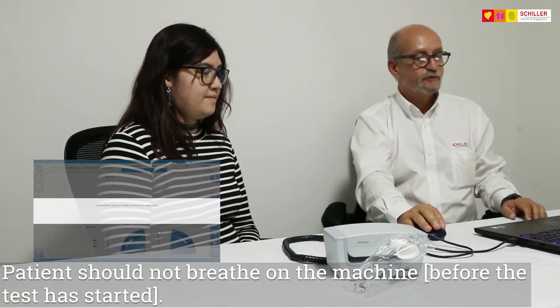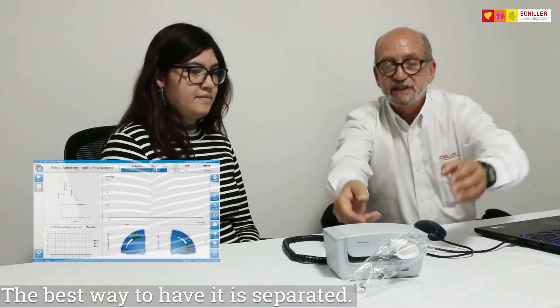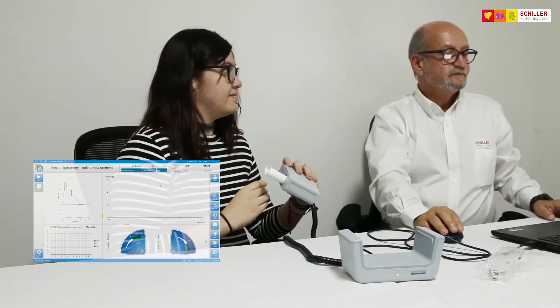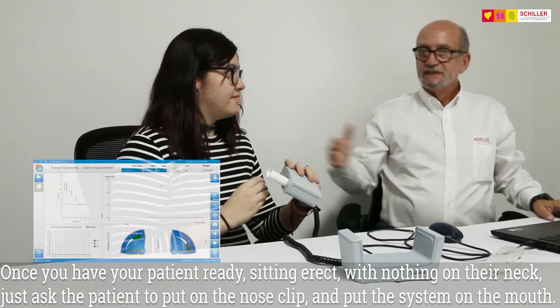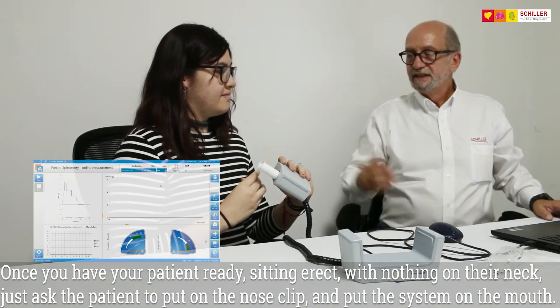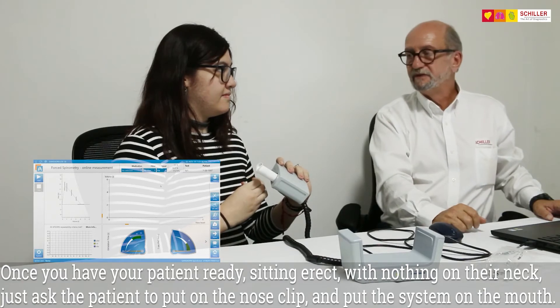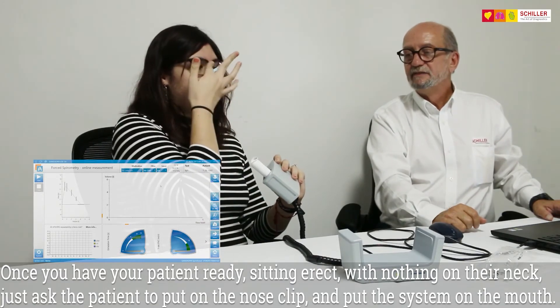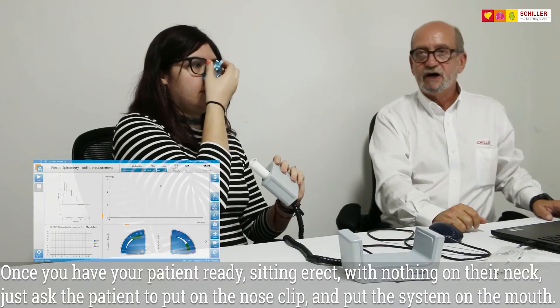The patient should not breathe on the machine. The best way to have it is separated. Once you have your patient ready, sit upright with no folds on the neck. Just ask the patient to put the nose clip and put the system on the mouth.